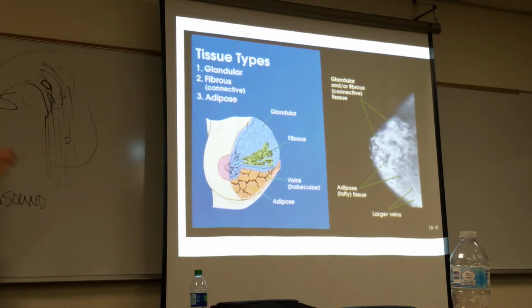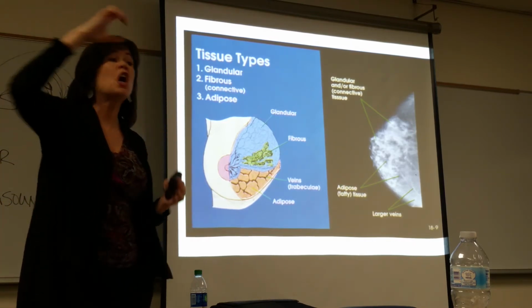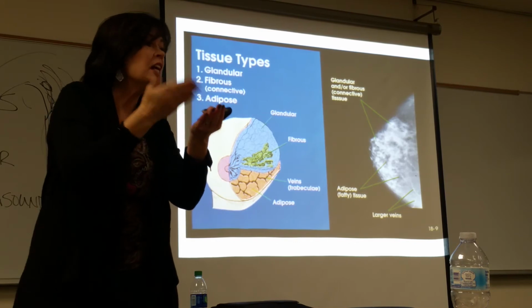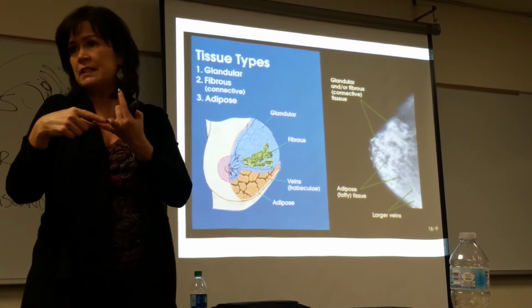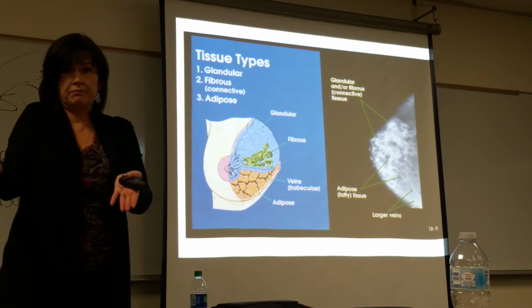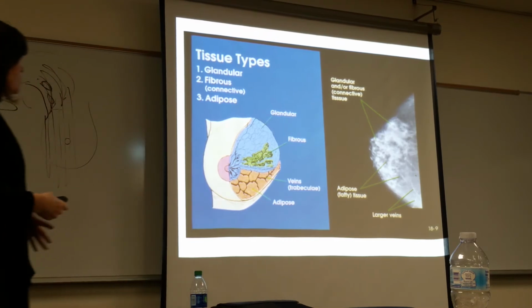Cancer tends to be what they call spiculated. So you might have the tumor itself and then you have these tentacles. It's not a round, circumscribed structure. If something is round and has smooth borders, that's typical or indicative of a benign tumor or maybe even a cyst. It's when the edges are striated, spiculated, star-like pattern. That's when we get a higher degree of concern.